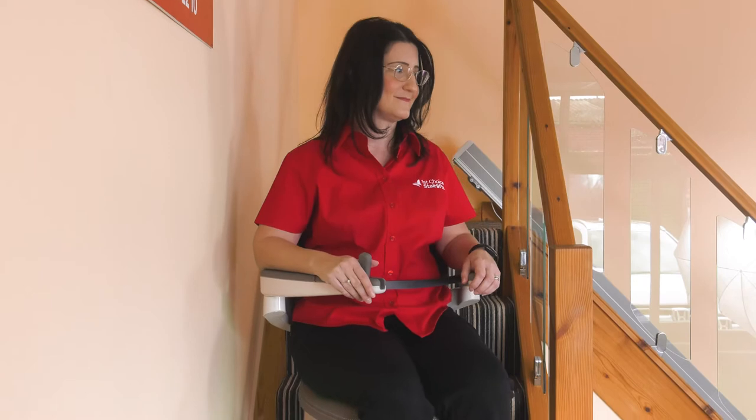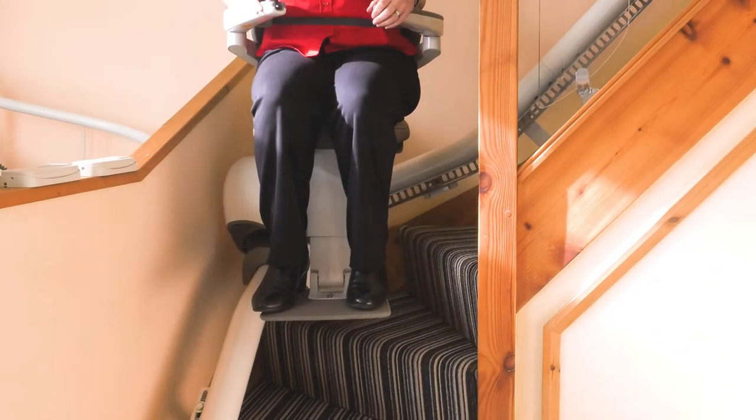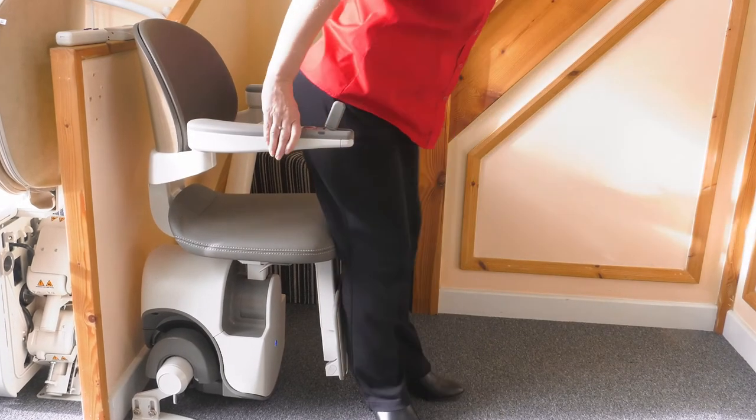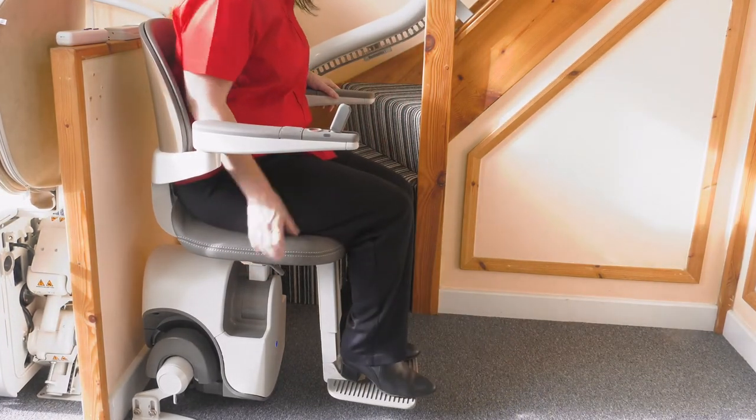If you think it could be tricky to fit a stair lift on a complicated curved staircase, think again. The Flow X is one of our most popular models due to its versatility and can fit any stairs. Thanks to its unique power swivel in travel mode, the chair is able to negotiate very narrow stairs. This lift has the lowest seat height on the curved lift market and a height adjustable footrest, making it perfect for petite users. Let us show you the great features on the Flow X and why it could be the ideal one for you.